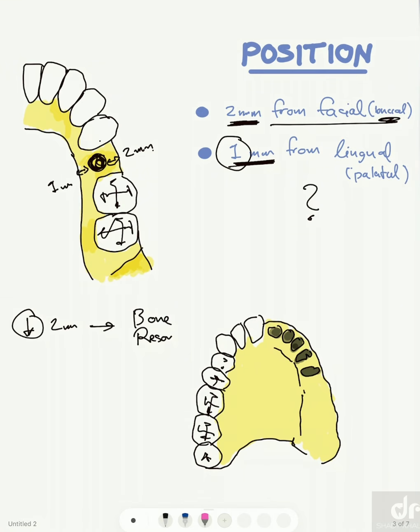We have to mention something very important regarding the early diagnosis of the width of the implant site. For beginners, or for practitioners who cannot estimate the real direction and real position for the implant, we can always go for the CBCT.